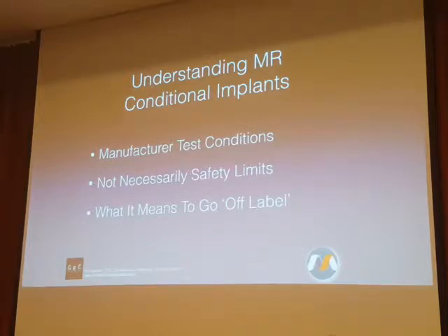And the manufacturer responded back to me and said, oh, thank you for pointing out the math error. Our attorneys are telling us to label it with the lower value, label it at 7,000, even though the math showed that you could label this up to 15,000.